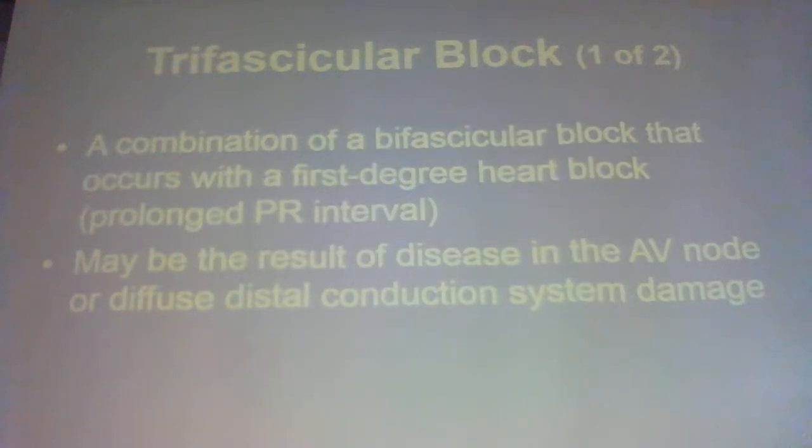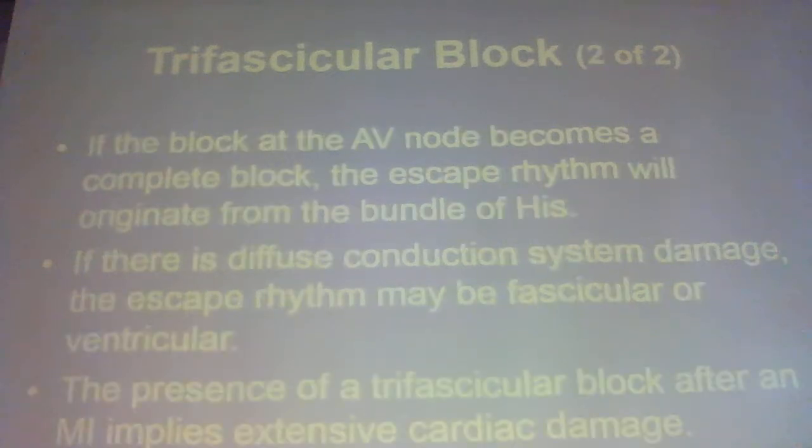What about that one? Trifascicular block. This is a bifascicular block that also has a first degree block, as a result of disease in the AV node or distal conduction system problems. You don't see these very often either.